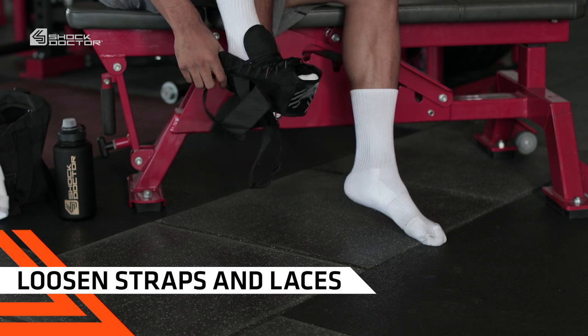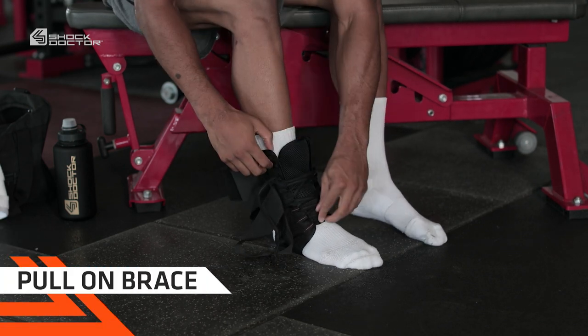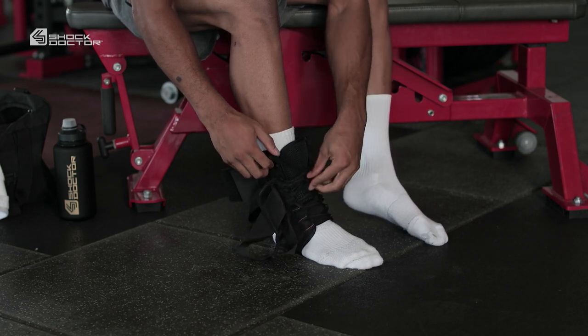First, loosen all straps and laces. Pull the brace on by using the convenient finger tabs on each side, making sure your heel is as far back as possible.